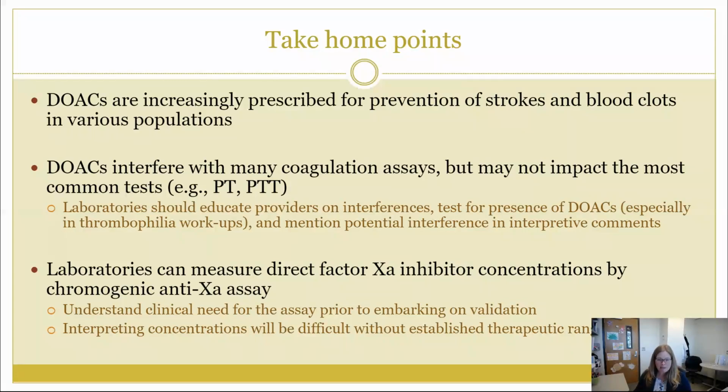And then it is possible to measure direct factor 10A inhibitor concentrations by drug-calibrated chromogenic anti-10A assays. But the validation process is resource intensive, and we still don't have clear guidance on how to necessarily interpret results because of the lack of established therapeutic ranges.